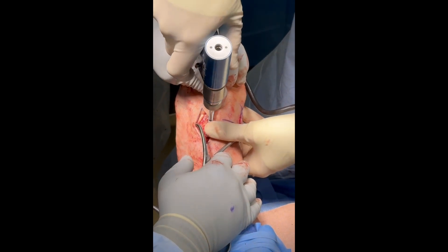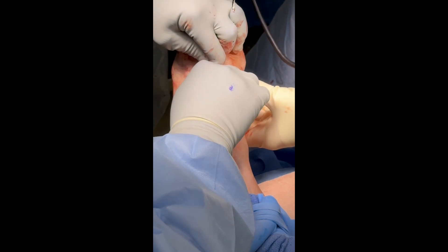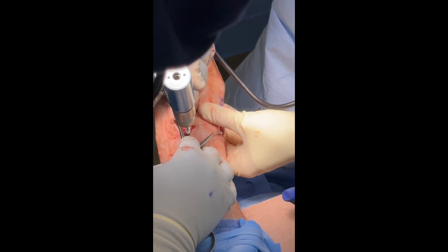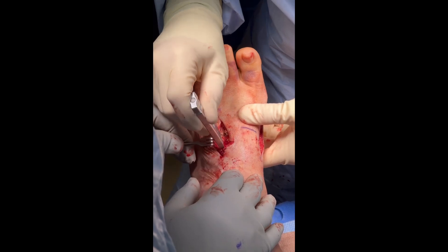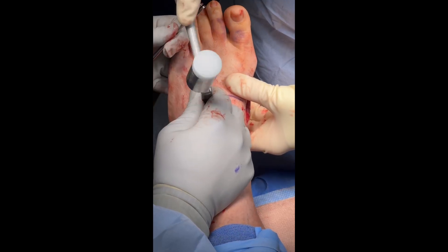The pointed reduction clamp is then applied to the third metatarsal base and the medial cuneiform to reduce the third TMT joint. A third staple is then applied in similar fashion across the third TMT joint by drilling and placing pegs. The staple is then placed with manual pressure and impacted into place.